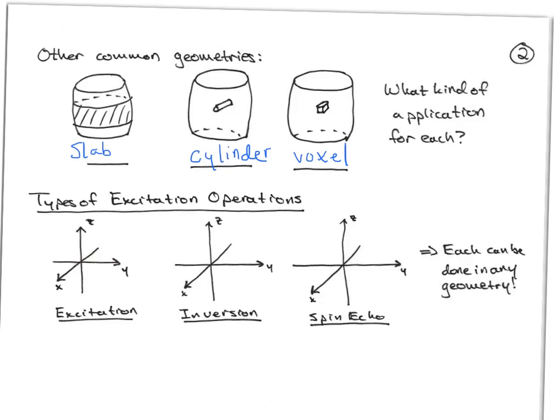So in the example I'm going to draw here, the magnetization M0 is initially pointing along z, and then it gets rotated down to the transverse plane, and it would rotate down to the y-axis if you had B1 pointing along the x-axis. So the rotation happens down here, and this is the magnetization after the pulse.